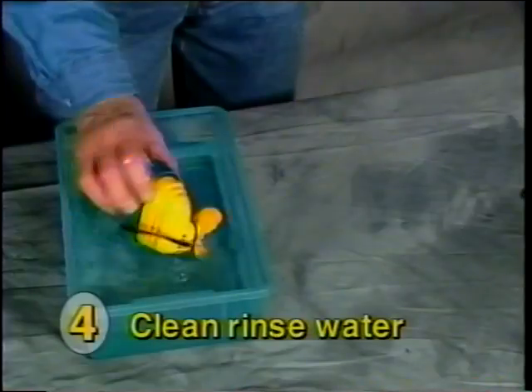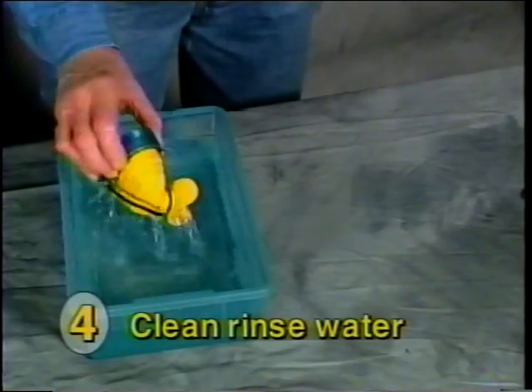Finally, place the mouthpiece in the fourth tub containing clean rinse water and then dry the mouthpiece.